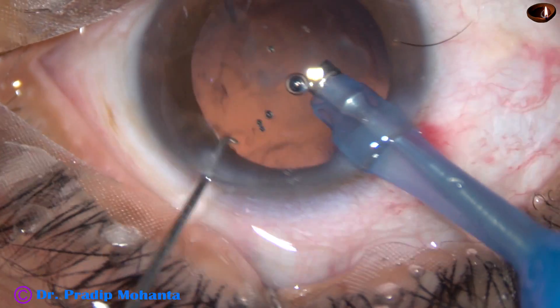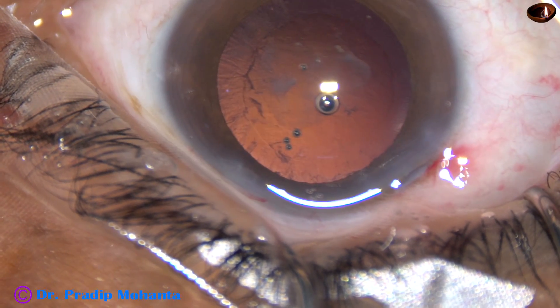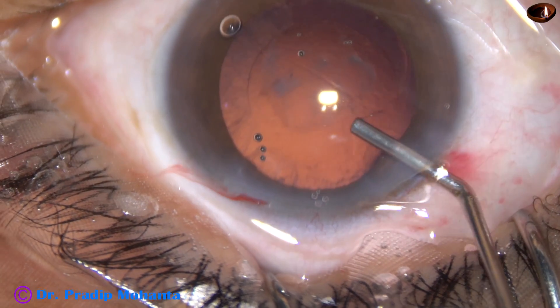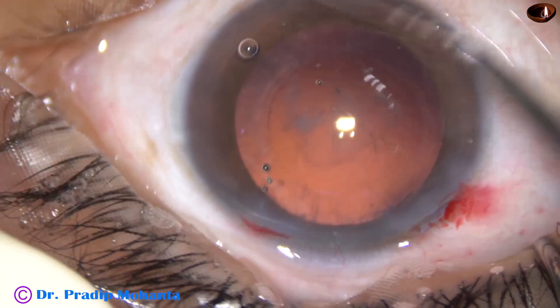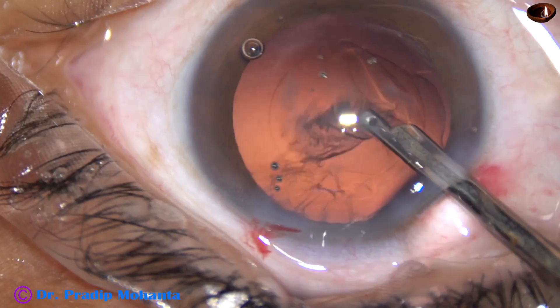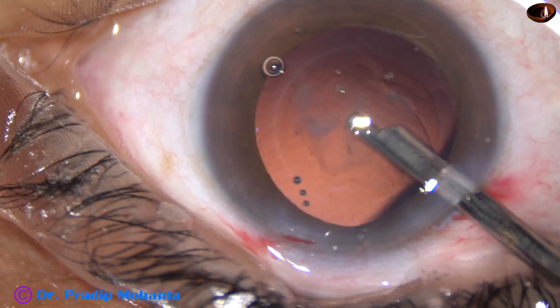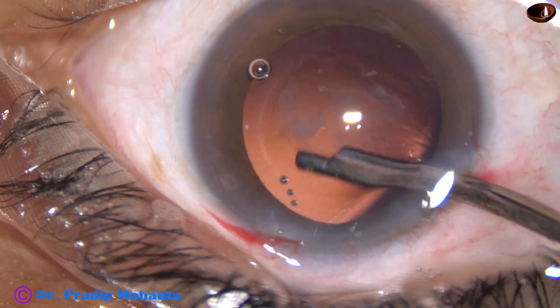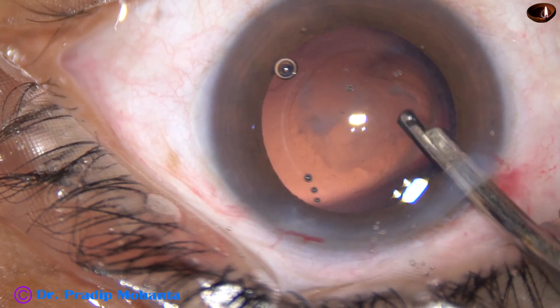One nuclear fragment is hiding just beneath the side port. Now, cortical clean-up is being done with the help of a 23G Simcoe. Because there is only one side port, one can use a coaxial I/A for this purpose. When there is only one side port, bi-manual irrigation aspiration cannot be used.